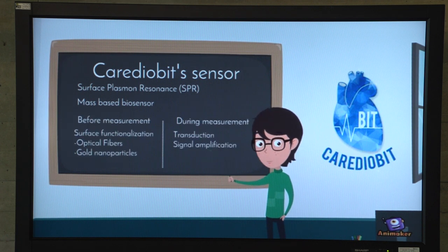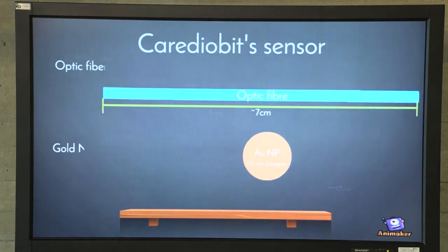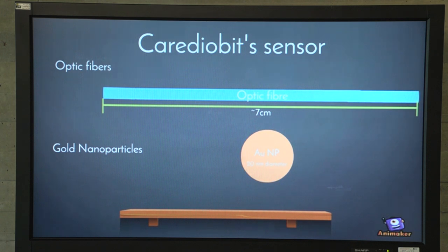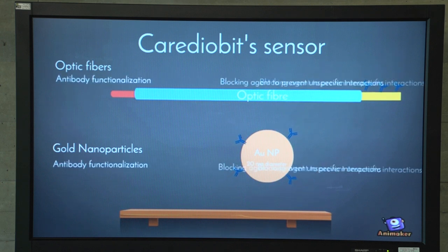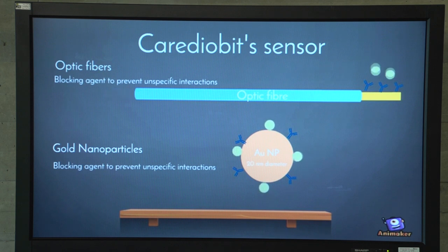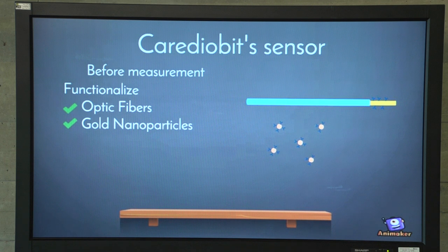Before measurements, we need to functionalize the surface of the optic fibers and of gold nanoparticles. For optical fibers, we have to remove the cladding from the edges and sputter gold onto the longest edge. We then functionalize the fiber and the nanoparticles with antibodies. To prevent unspecific interactions, we add a blocking agent. Our fiber and particles are then ready to be used.